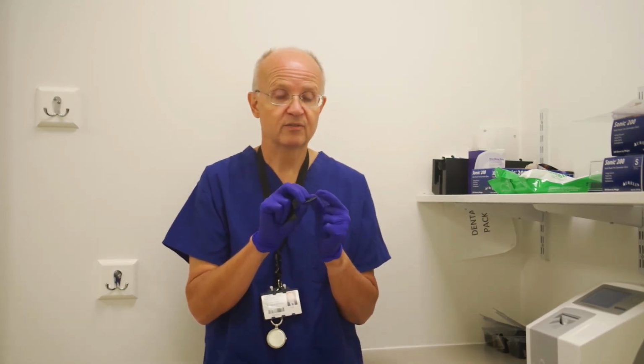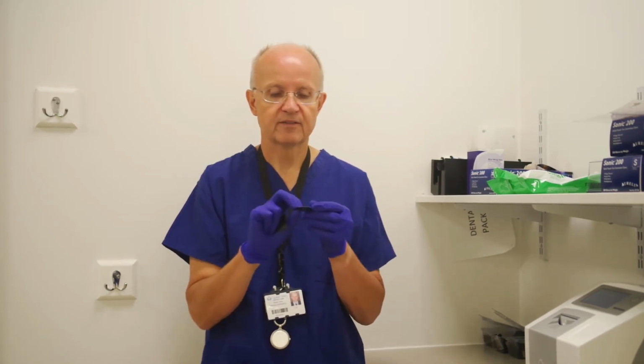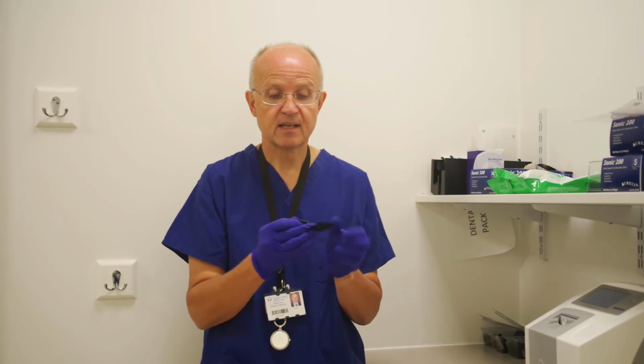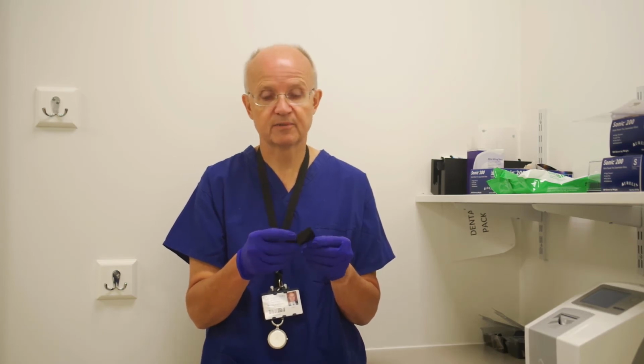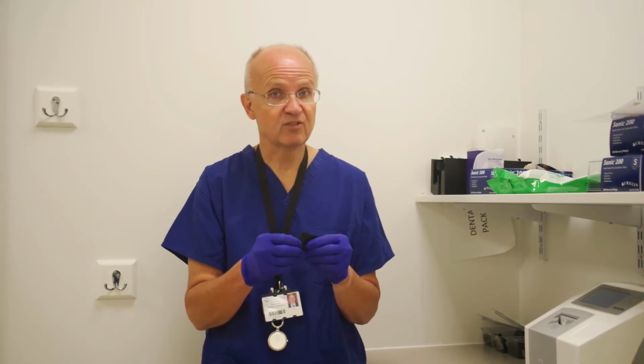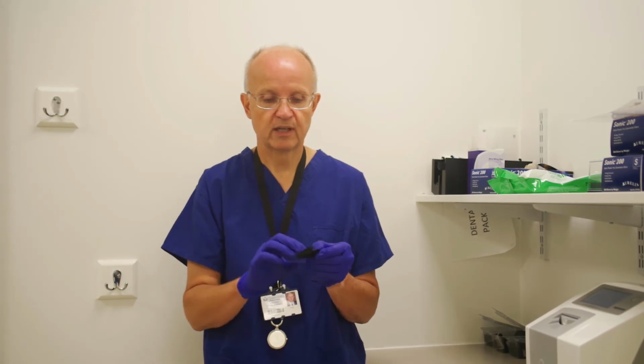What we need to do is either repeat the image, or electronically flip it, but if we do so, we need to record that so that anyone else looking at that film knows it's the right-hand side and not the left. That's a really, really important thing for you to remember, because we have had incidences, not just here but in other hospitals, where the wrong tooth has been identified and in some cases extracted on the basis of an X-ray that's been flipped all around. So really, really important, remember to place this in the right way in the mouth.